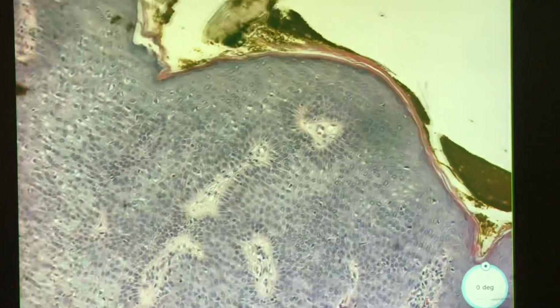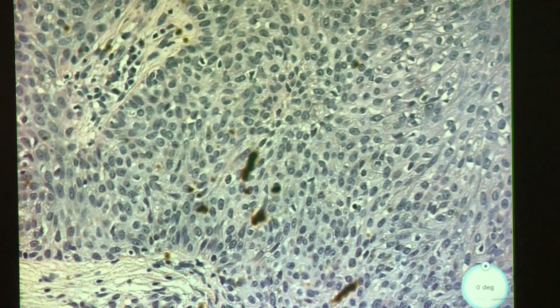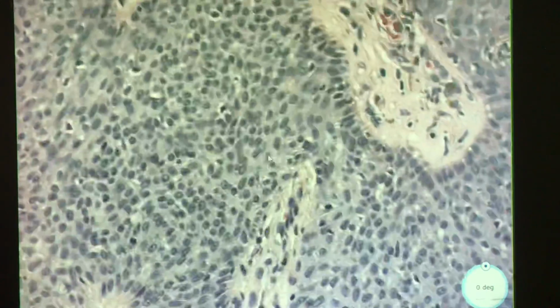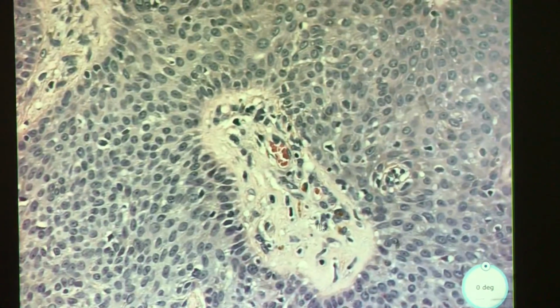Well, this is not what this epidermis should look like. There's all these cells. Let's see if I could make heads or tails. Well, there does seem to be some melanocytes in there, in the epidermis. And then those melanocytes or something else? They could be something else. So, actually, pretty much all the cells you're looking at are melanocytes.